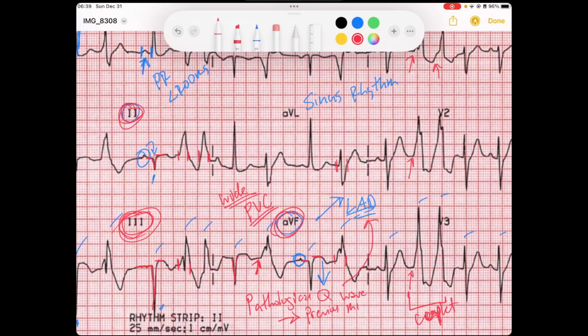We often see premature ventricular contractions occurring as an ominous sign at the end of a myocardial infarction, because this fibrous ischemic tissue is very proarrhythmic.